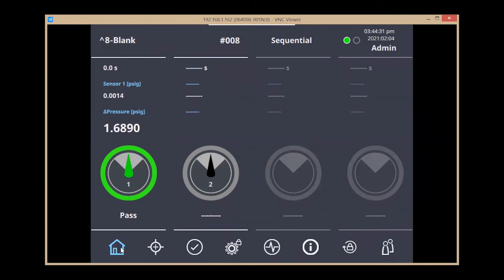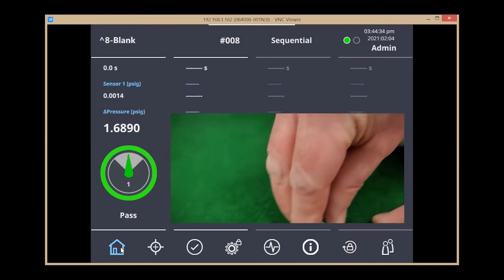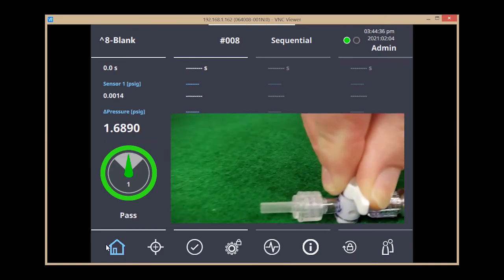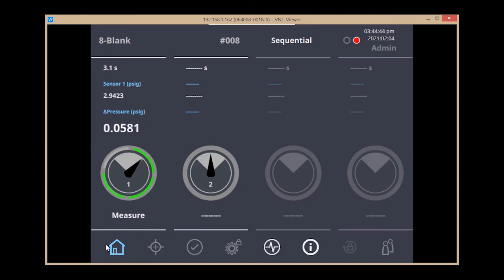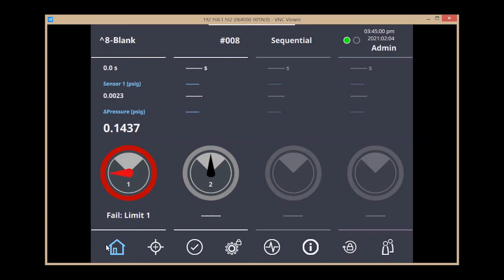Now I'm going to close my valve to simulate an occluded part and start the test. Using the same program, it's filling for five seconds, now moving on to the measurement step, and the pressure drop in this case was 0.1437 psi. This is less than one, so there's a blockage in the part and no free flow of air, resulting in a failed part.